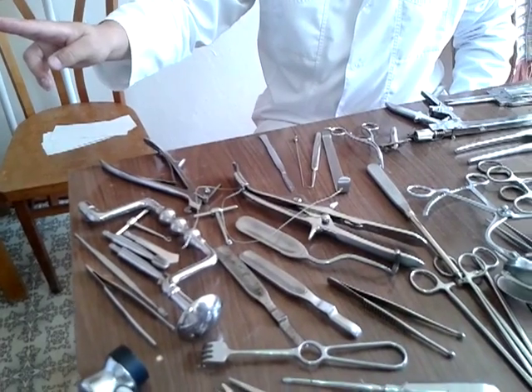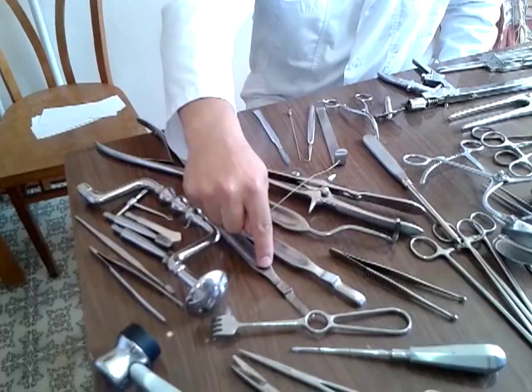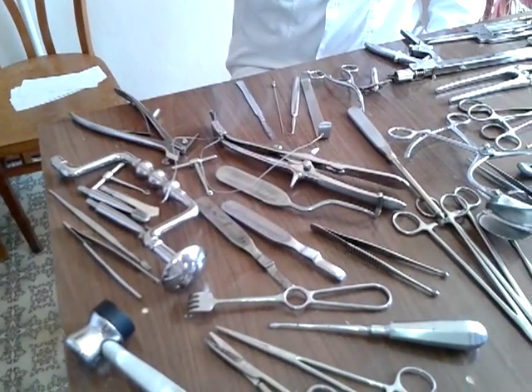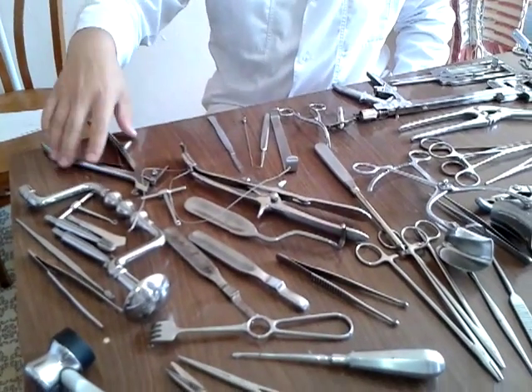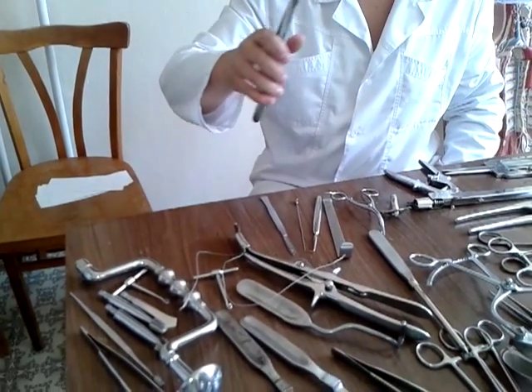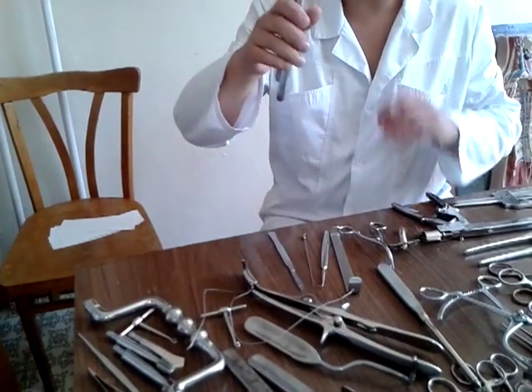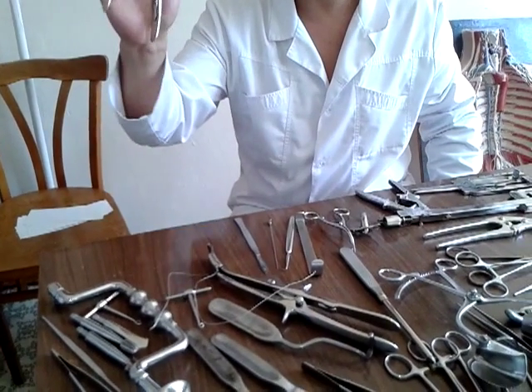The second type is the decompressive or resectional. The first instrument is the same, the raspatory. The second instrument is the same, but we make only one hole, in the center. After that we use Dahlgren's bone cutter to enlarge the hole, to resect the bone. That is why it is called resectional. Dahlgren's bone cutter.